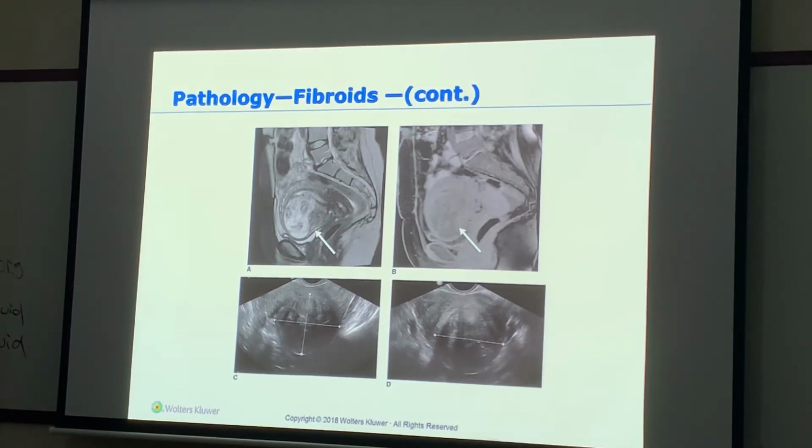Shadow. Edge. Posterior shadowing. Yeah. So we know that we have a very old fibroid that has necrosis. It has solid components. It's got fluid components. It's got shadowing. So there's got to be some type of a calcification in there that causes that. And look how beautiful it looks on MRI.